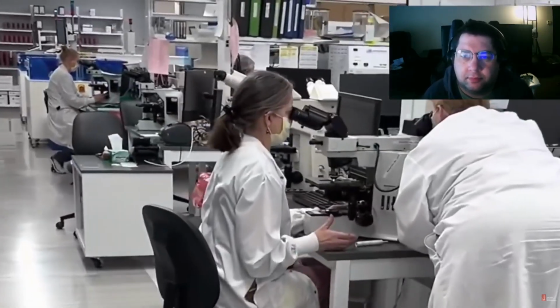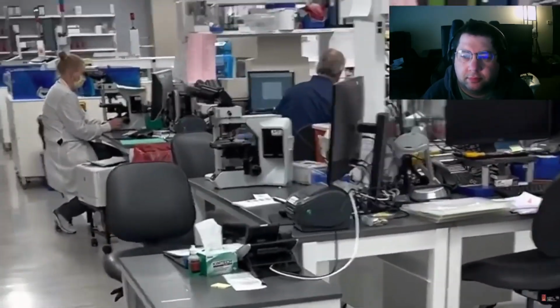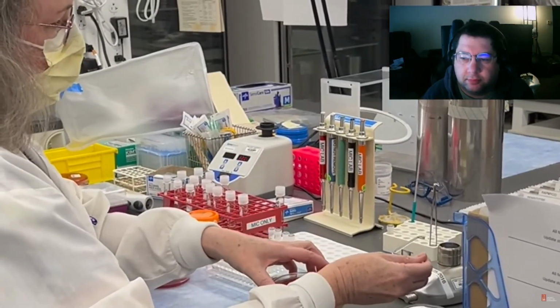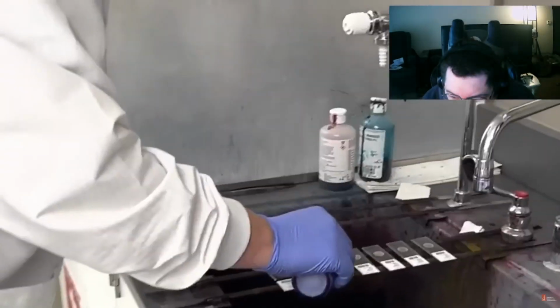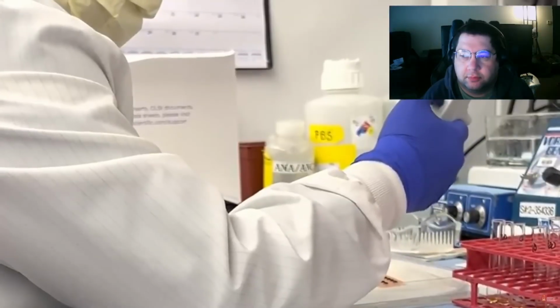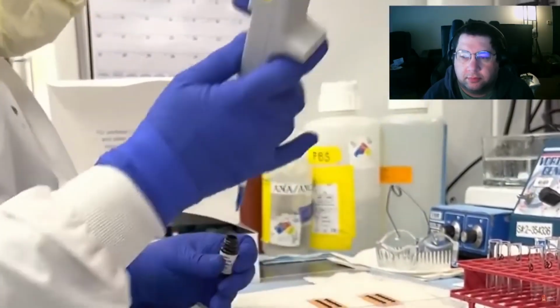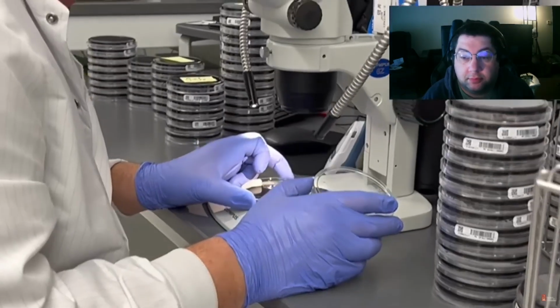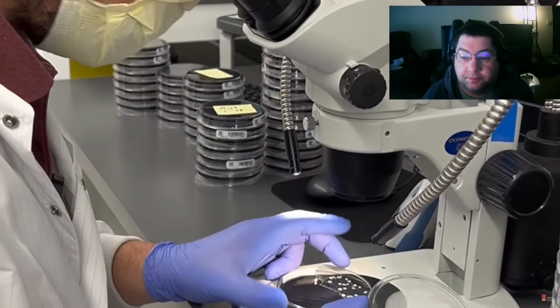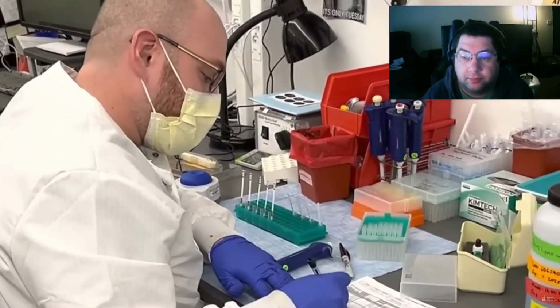Clinical microbiology laboratories play an important role in patient care by detecting, isolating, and identifying microorganisms that cause infections. The field of clinical microbiology is multifaceted and multidisciplinary. Here at UR Medicine, we perform bacteriology, immunology, mycobacteriology, mycology, parasitology, serology, and virology testing to assist clinicians in the diagnosis and management of patients with infectious diseases and immunological disorders.